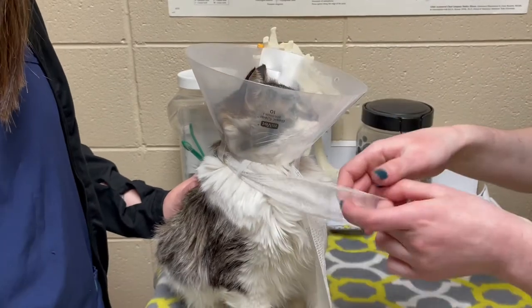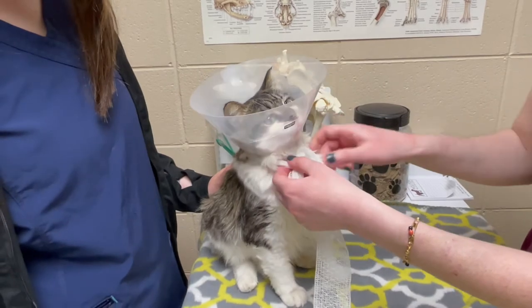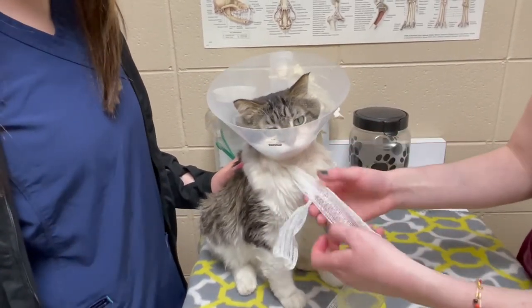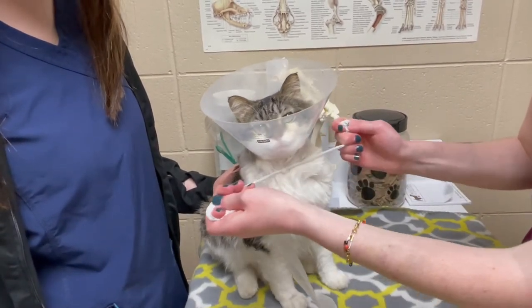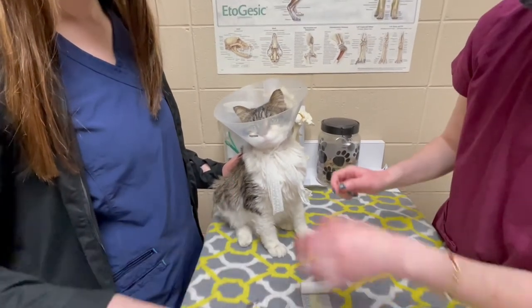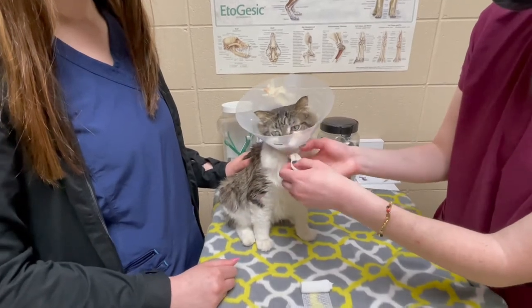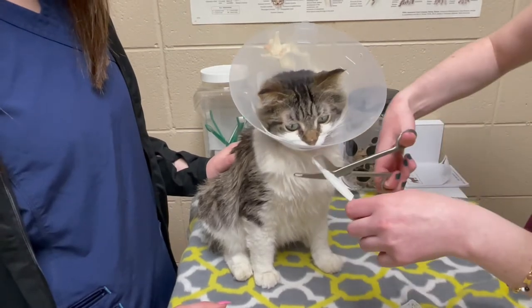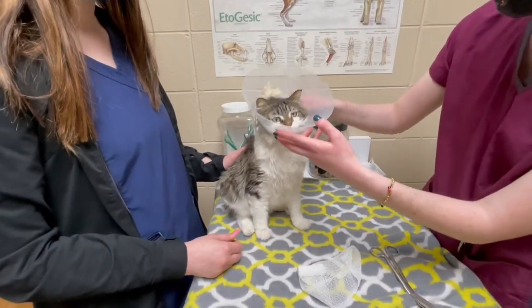And then we'll want to tie a little bow. We want to make sure it's tight enough that it'll keep him from getting the cone off of his head, but not so tight that it'll choke him — so make sure you can still get a finger behind there. And then we'll cut that short and double tie it just in case, then cut off the excess. That should keep him from getting the cone off without choking him.